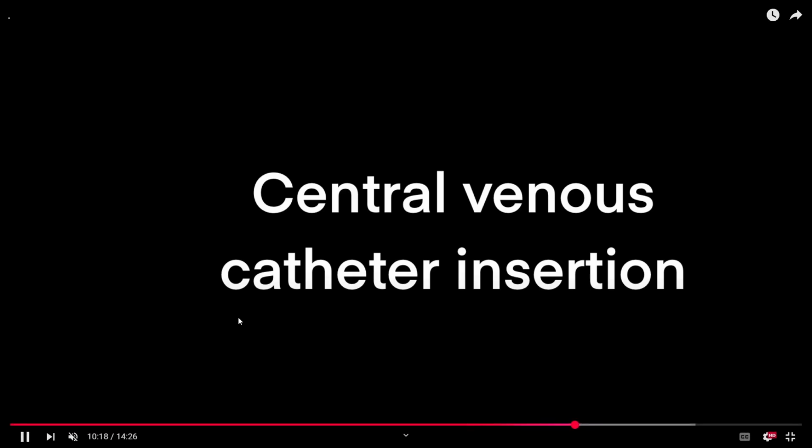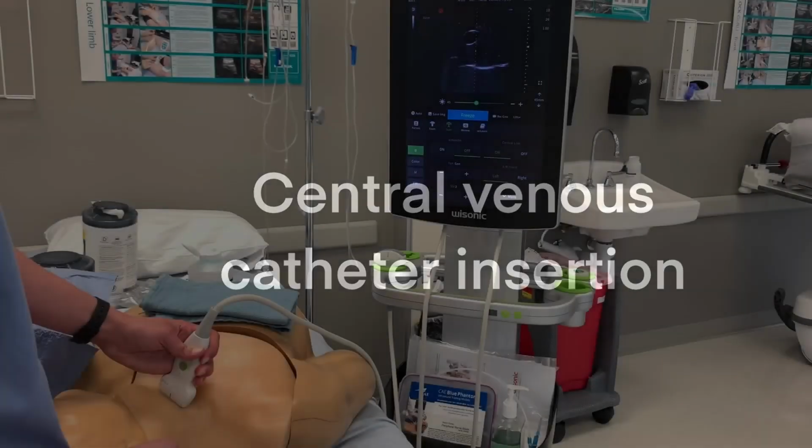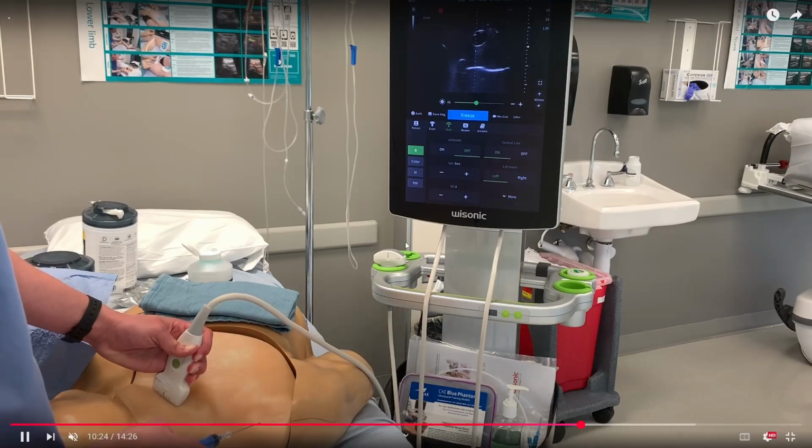Now for central venous catheter insertion. In this case we're doing right internal jugular vein. So let's break down what we're looking at right here. These are settings for the ultrasound machine. This is what the ultrasound probe is seeing. This is the ultrasound probe. And then here's me.